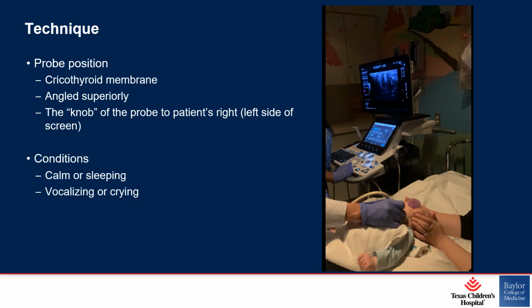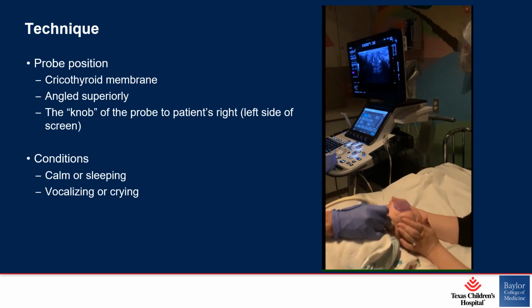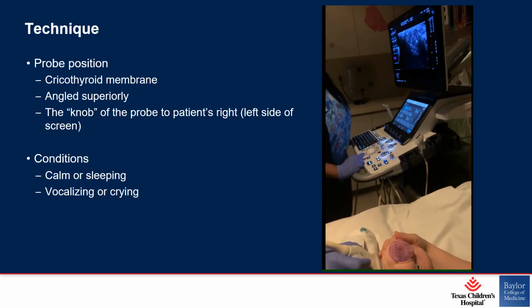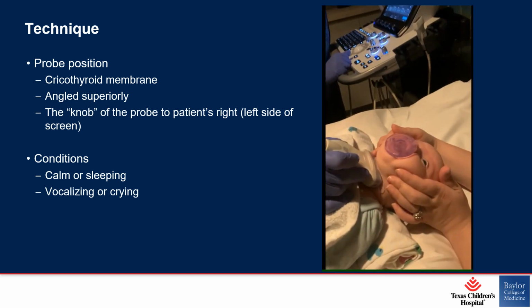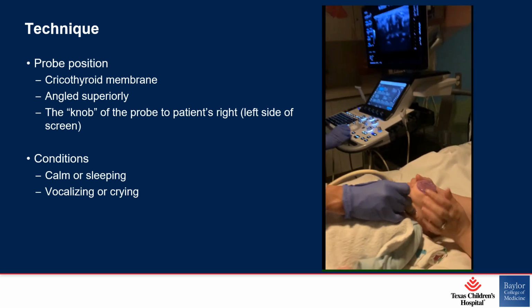We generally evaluate two conditions. One is with the baby calm or sleeping, and then we remove the pacifier in order to visualize vocalization or crying. In older children, you can just ask them to do it for you. Okay, and this is with the baby at rest. And then if we can remove the pacifier.